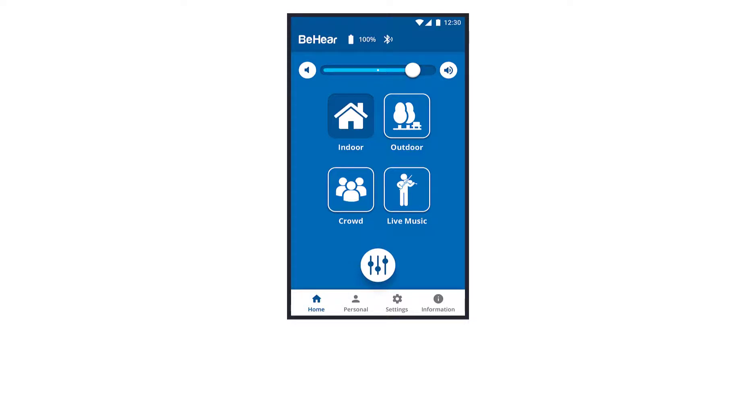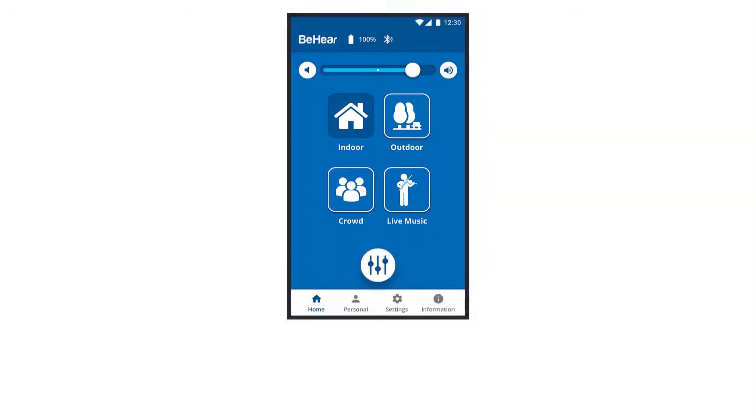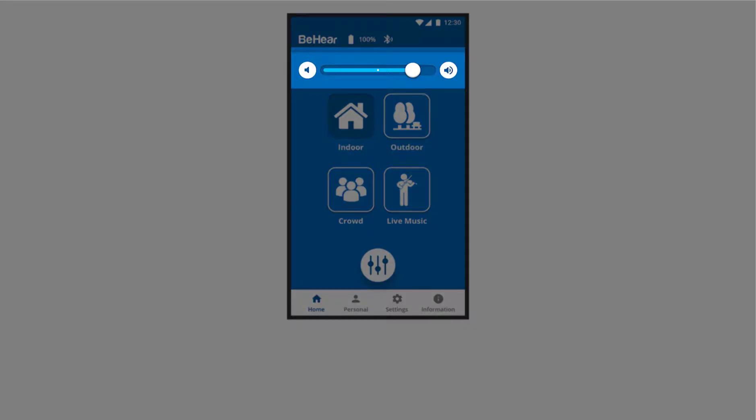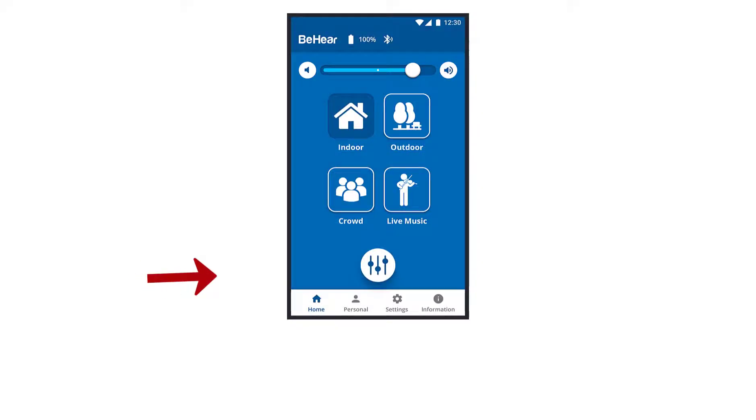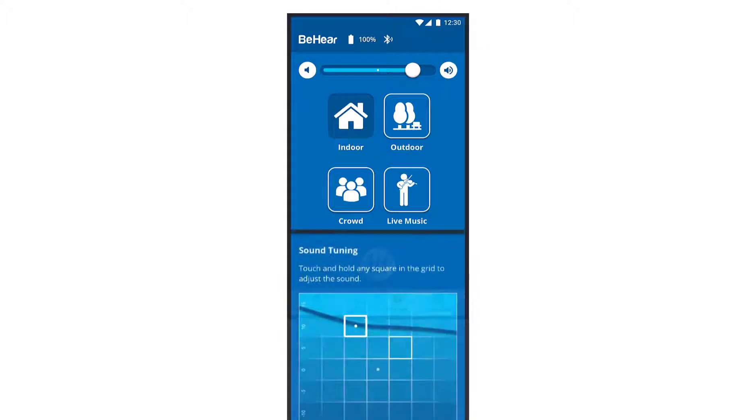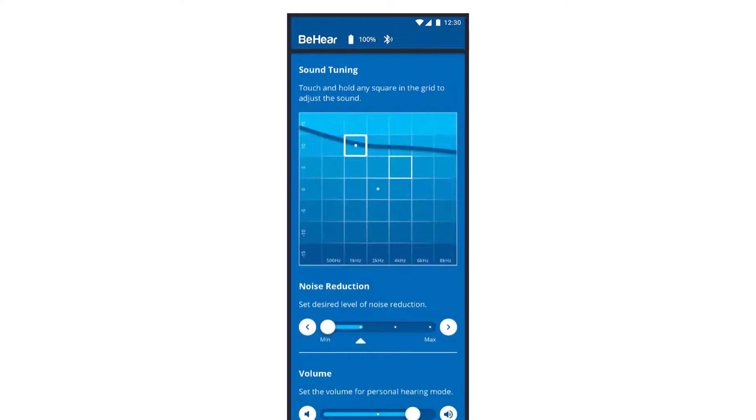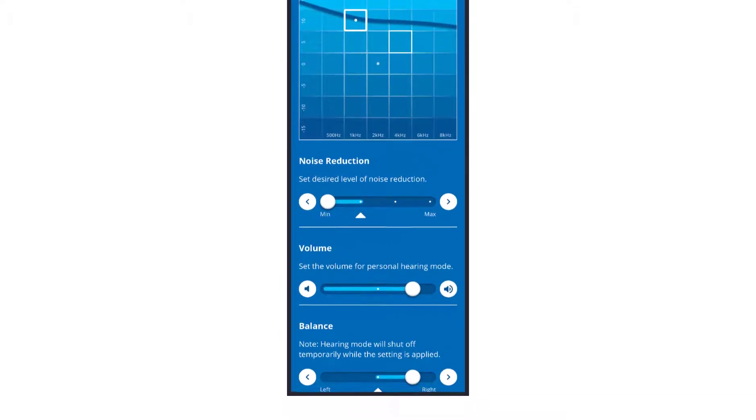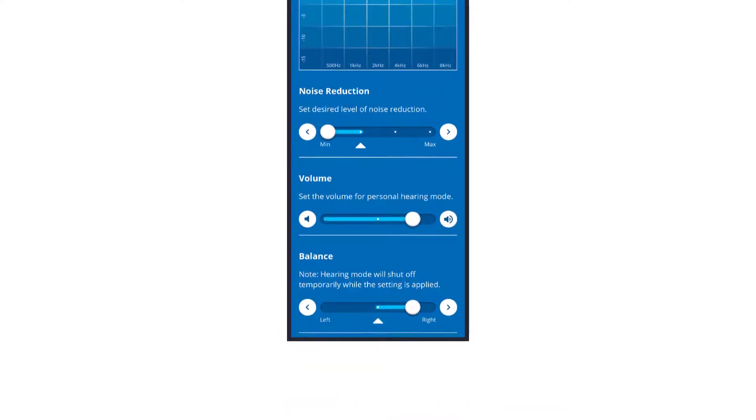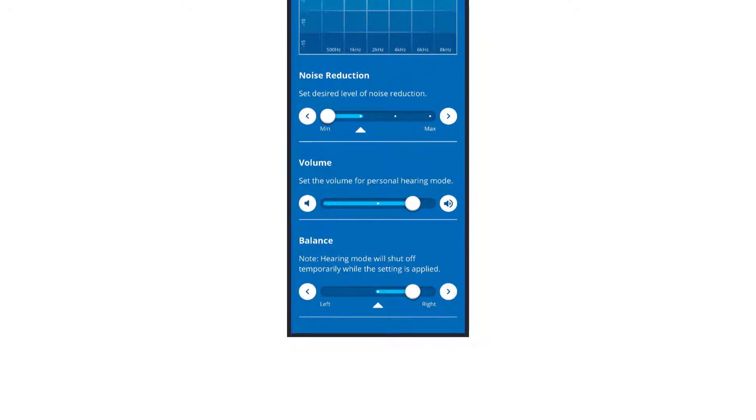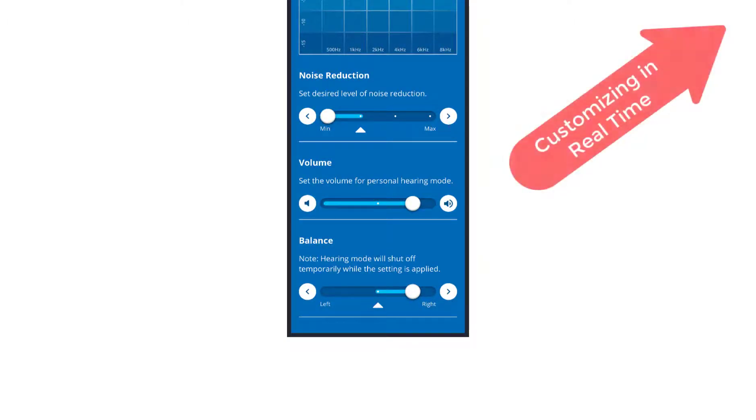choosing the hearing preset, changing the volume, determining the BSP, best sound point, defining the noise reduction level, setting the balance between ears, etc. To learn more about these options, watch the customizing in real-time video.